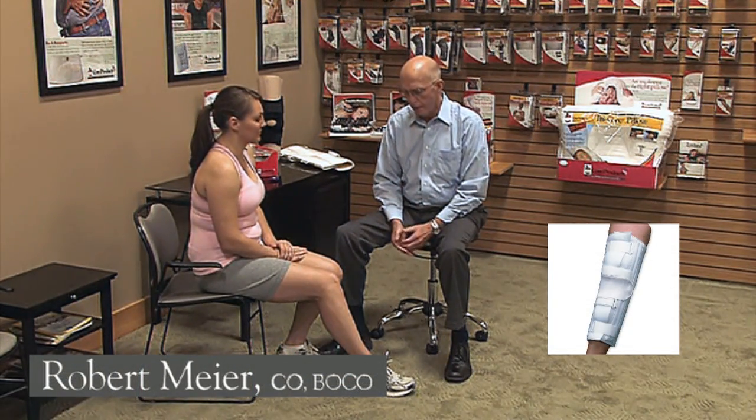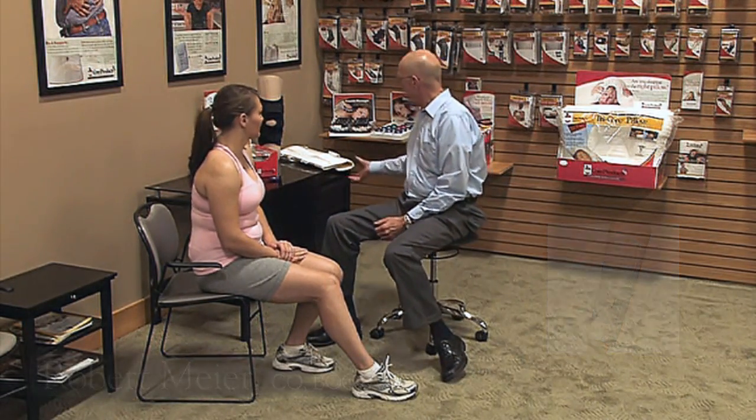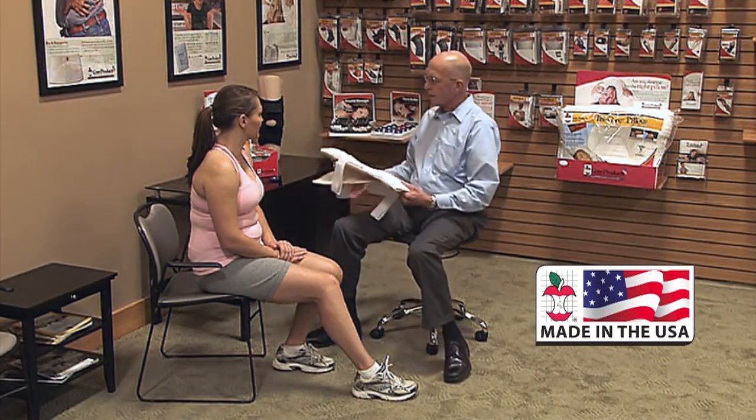This segment is going to cover a universal knee immobilizer. Because the universal measurements do not need to be taken, we'll just show you the application of the device.